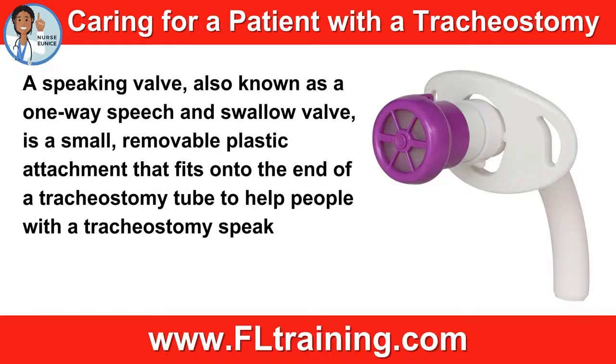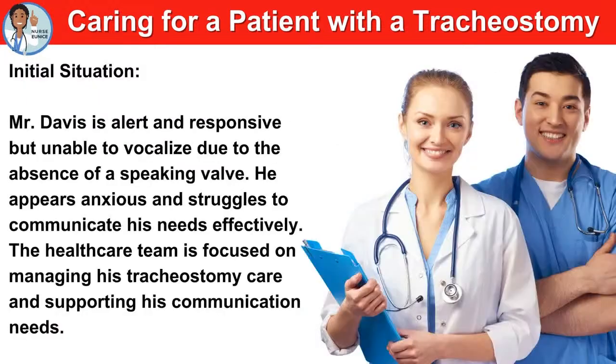And here's another example of a speaking valve, also known as one-way speech and swallow valves. It is a small removable plastic attachment that fits onto the end of the tracheostomy tube to help people with a tracheostomy tube speak so that they can communicate. So Mr. Davis is really frustrated. He had a respiratory infection, ended up trached, and now he's trying to communicate and no one can understand him. And you are the caregiver.